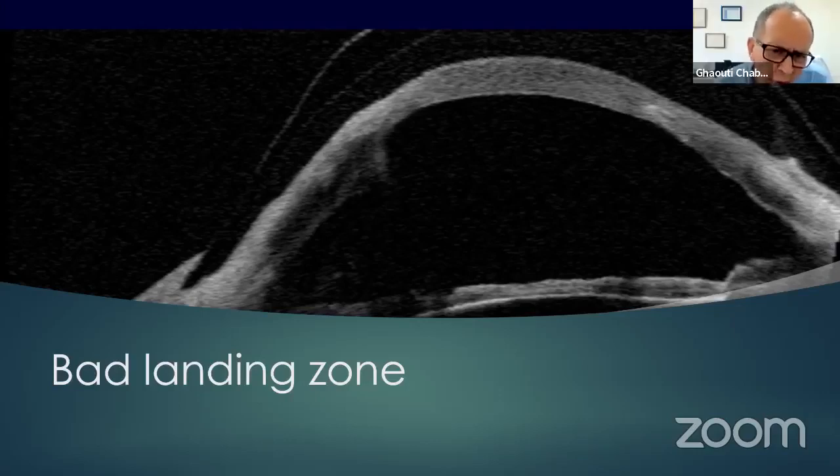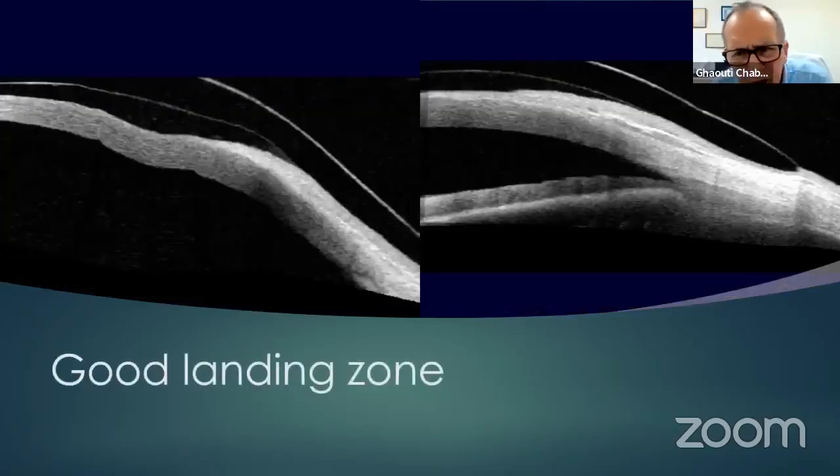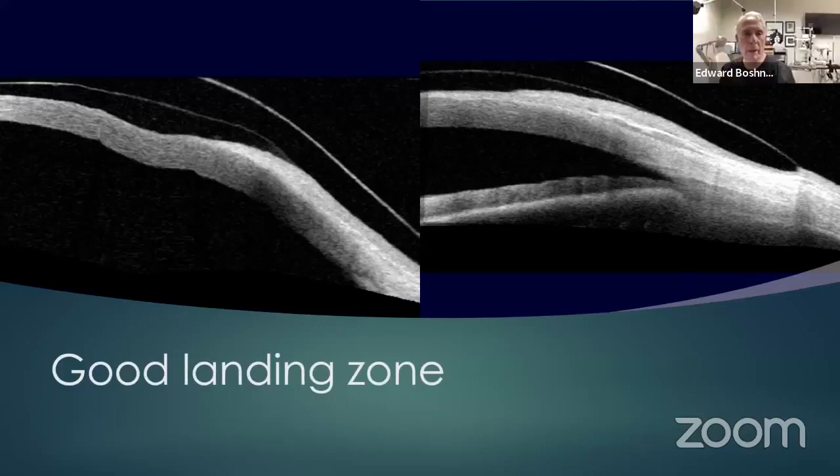And what's the ideal landing for you? Like that. It's tangent to the sclera. Yeah, you want a tangent, and the longer the landing zone, as a rule, the better it is. It's like if a woman steps on your toe with a high heel shoe as opposed to a sneaker. You're distributing the weight of the lens over a wider area. It makes for a more comfortable fit.